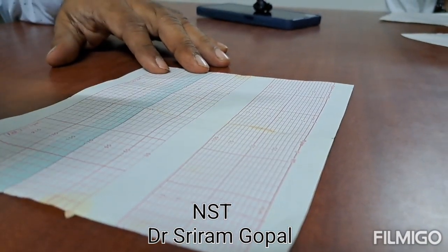Uterine activity means pressure, in millimeters of mercury, or kPa. What does kPa stand for? Kilopascals. Okay, and FHR is in BPM. What is BPM? Beats per minute. Okay, it's the heart rate. It's the fetal heart rate, beats per minute.